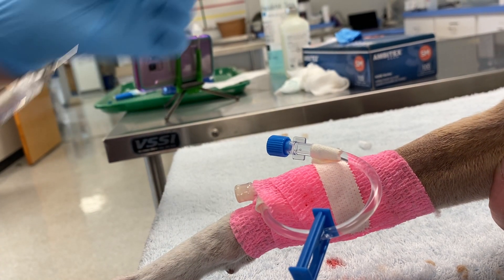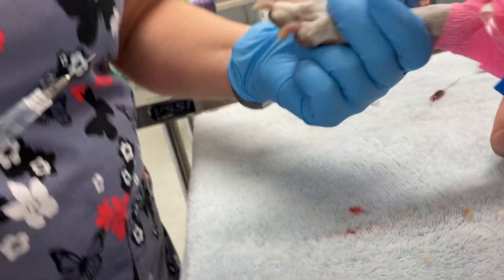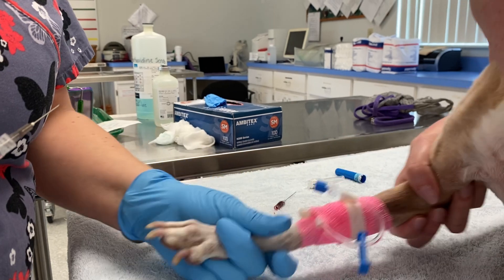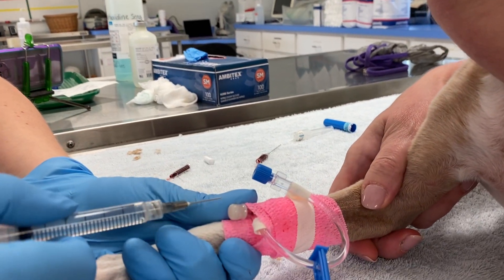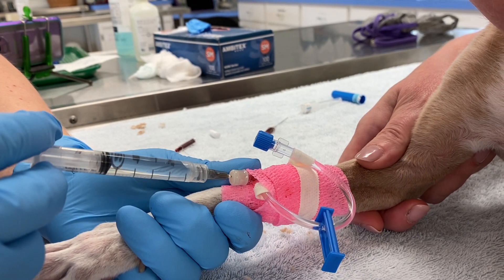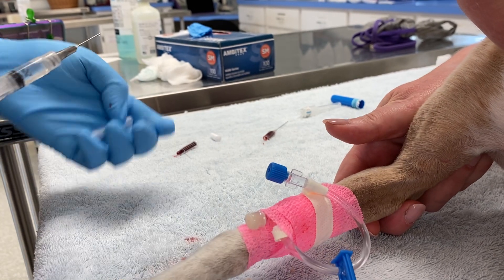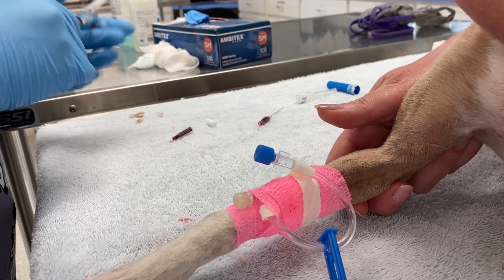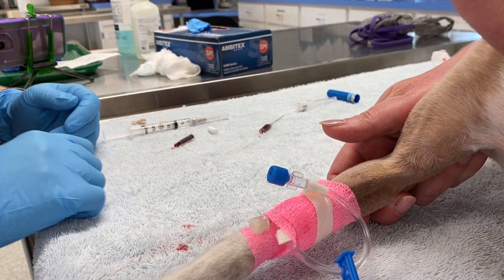This is the part where you have to make sure that everything is good. Your holder is going to put their thumb or their finger — oh, I'm sorry sweetie, you let go. Obviously nothing actually hurt the dog; she just got a little spooked. And they'll let you know if they feel it. And now you have a catheter in. No pets were harmed in the filming of this video — just freaked out.